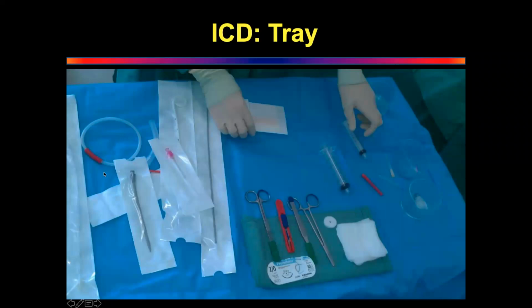Is Fitun still with us or no? Yeah, I'm here, sir. Okay, Fitun, I've given you this tray. I'll keep pointing and I want you to identify. I've never seen a pigtail insertion. Okay, forget that. Somebody else take it. Who wants to take it? Shilpa, take it. What are these two syringes for? Luer lock 5 ml and 10 ml syringes. For what?